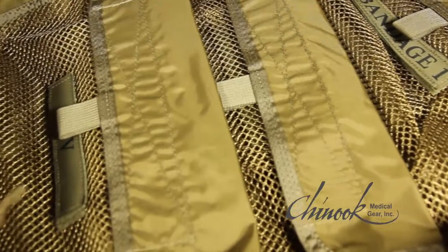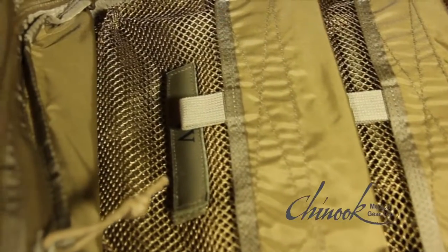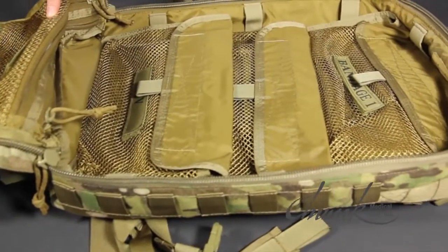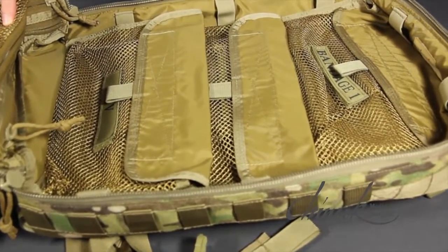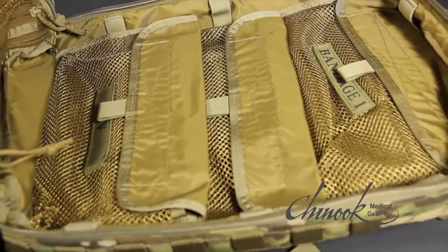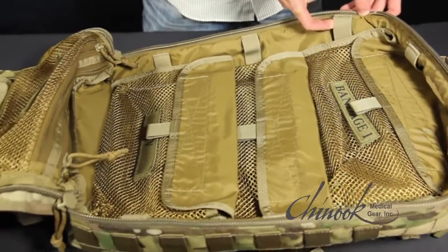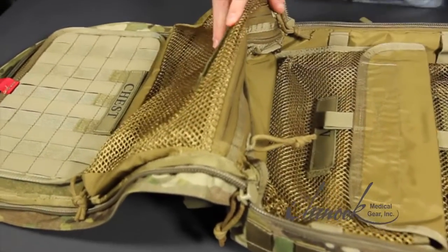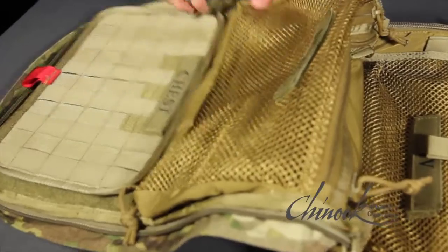The TMK-MO bag has the same internal design as Chinook's larger and highly popular Medic Pack. The inside of the MoBag features five removable Velcro supply pouches, eight elastic retainer bands for loose supplies, three permanently mounted supply pockets, and a removable instrument panel.